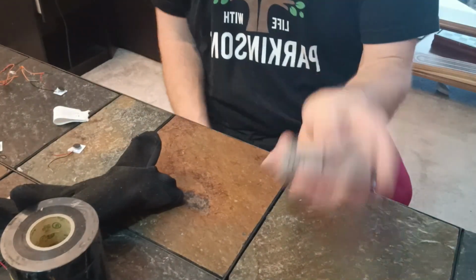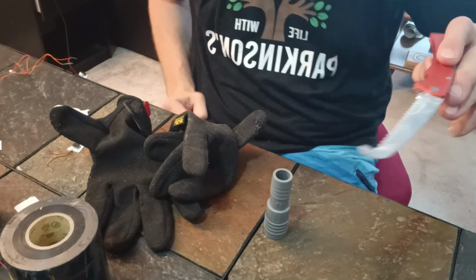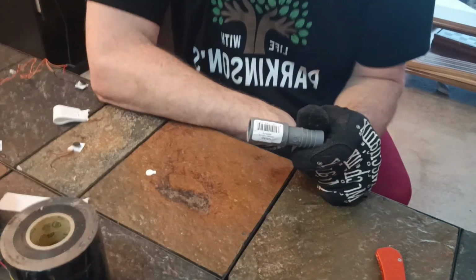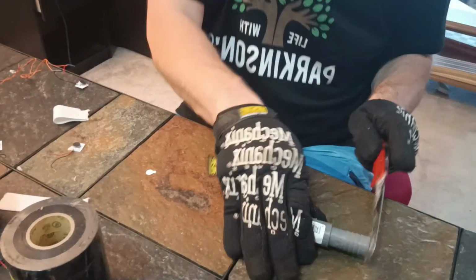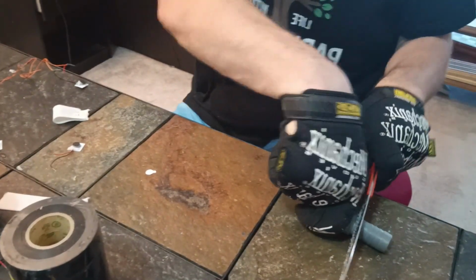And I'll go through the steps right now, but I just wanted you to see this. I'm getting really excited because I think I'm actually going to have both gloves working at the same time. I've got a couple of these guys left. These are 1 inch to 3/4 PVC conversion pipes. So I've got a little saw for this, and I am going to put on my gloves. And I'll just walk through the steps of what we're doing. And like I said earlier, the great thing about this is when the motor gets in there and it starts to vibrate, this whole pipe becomes part of the vibration system, and you get really good coverage. And I'm really excited to try them with both of them working and to see what response I get.